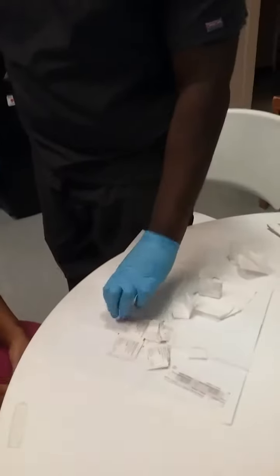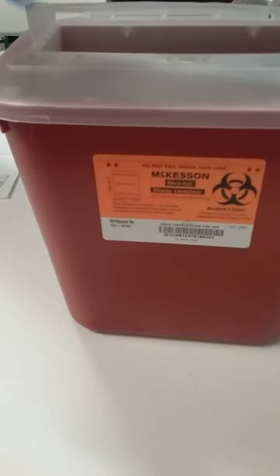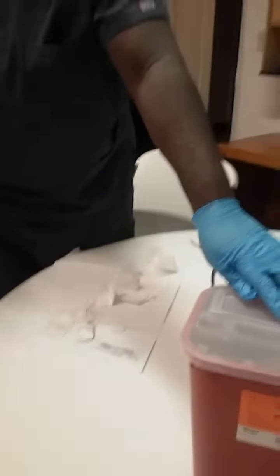We take all of our sharps and we put them in our sharps container. Make sure your sharps container is labeled with the biohazard sign, and it must be leak proof and puncture proof, so no one can get poked, or so no biological fluids will leak out of it.